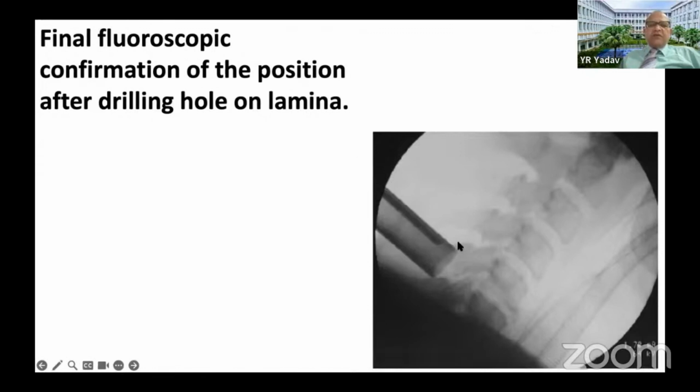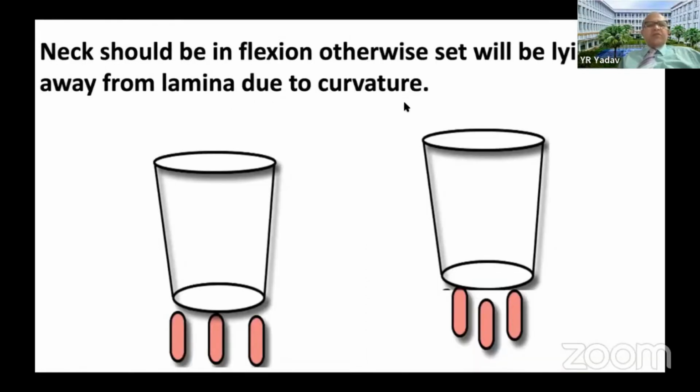That will be my orientation, and then I go cranial caudal depending upon how many laminas are involved, and then remove those hemilaminae, and obviously the opposite side.